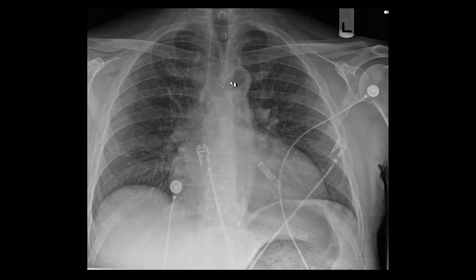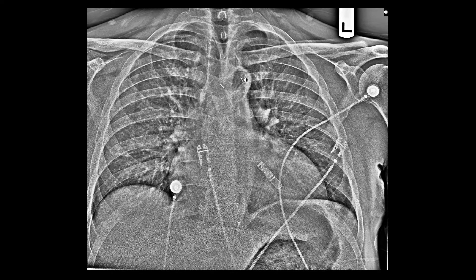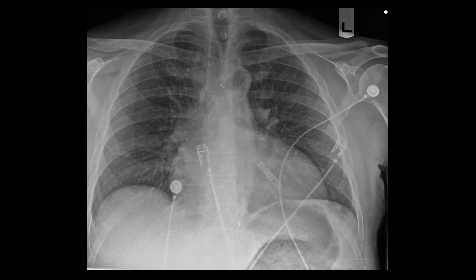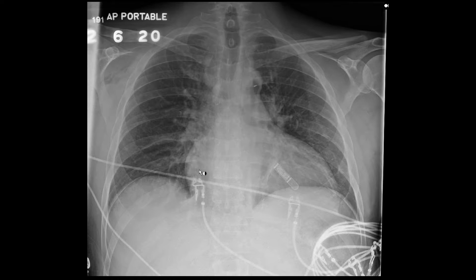Here is an example of a balloon pump that is positioned too proximally — also placed via the axillary approach. The balloon is partially inflated within the aortic arch as well as in the descending aorta. The proximal and distal markers confirm that the balloon extends into the aortic arch itself, which is not ideal positioning. This device was subsequently repositioned more distally to avoid occluding the arteries supplying blood to the brain.